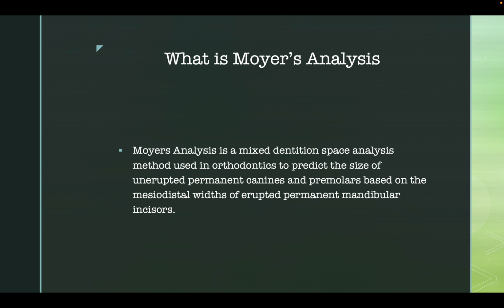So, first, what is the Moyers analysis? The Moyers analysis is a mixed dentition space analysis method used in orthodontics to predict the size of unerupted permanent canines and premolars based on the mesiodistal width of erupted permanent mandibular incisors.